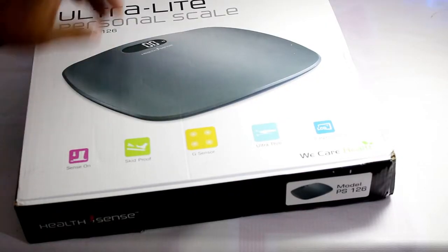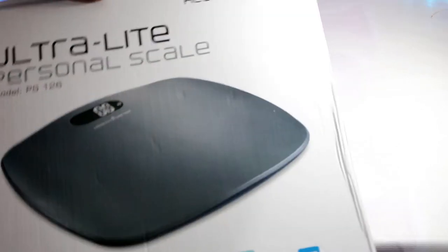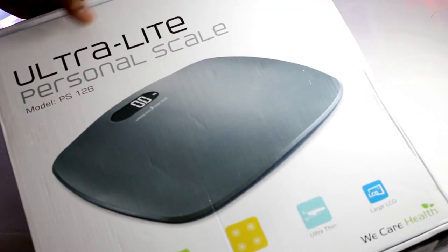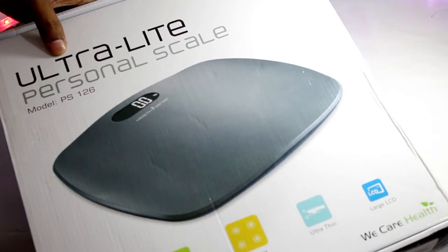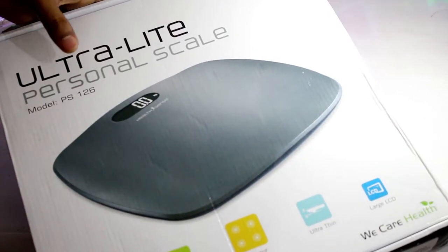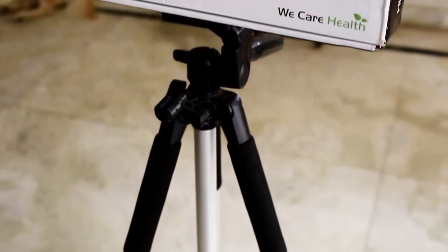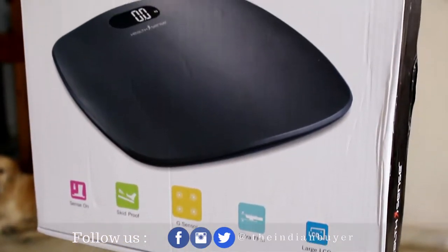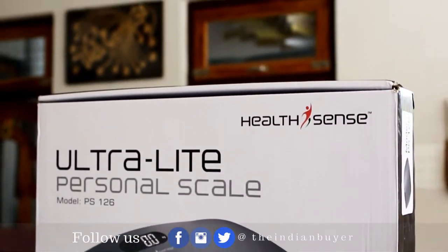So guys, here's the box. But before we go ahead and unbox it, let me give you a quick overview of this packaging. On the front you will find everything is clearly mentioned over here, and there's a huge pictorial representation of the weighing scale as well.